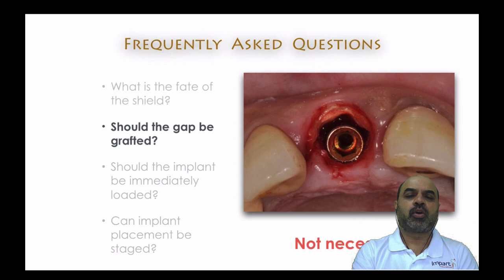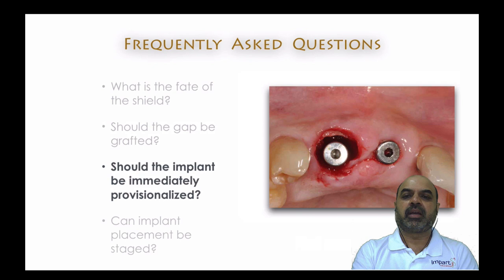There is still no consensus on it. Personally, I do not graft this gap, but I also know of some very successful clinicians who make it a point to graft that gap. Should the implant be immediately provisionalized? The answer is again not necessary.